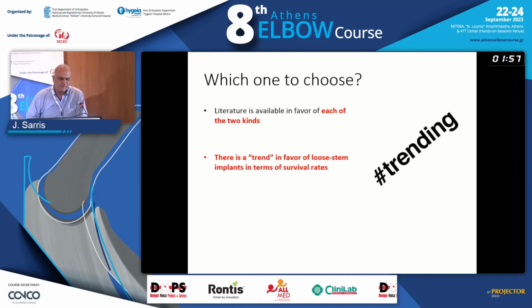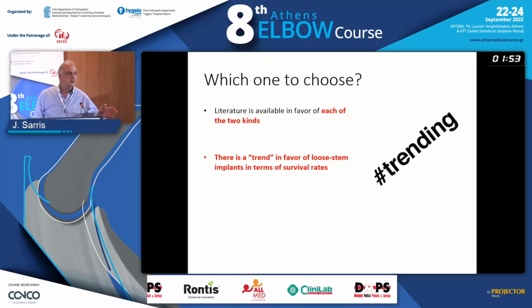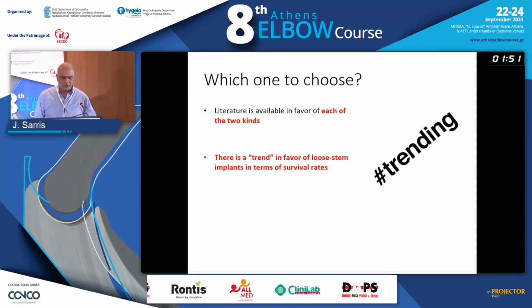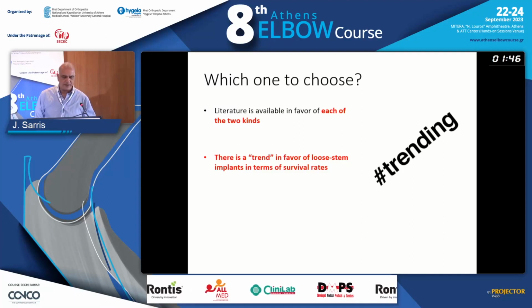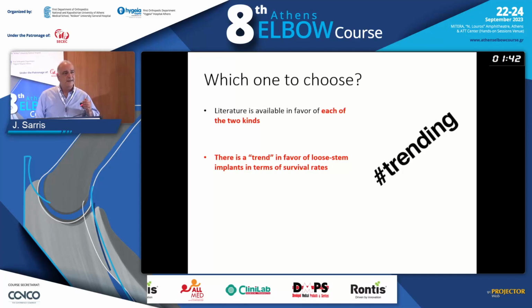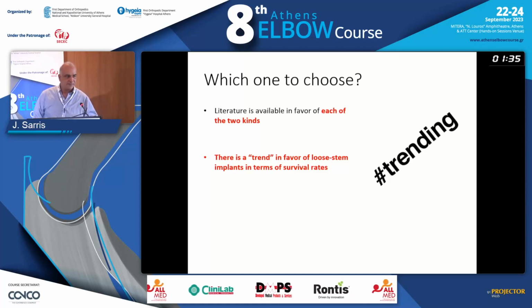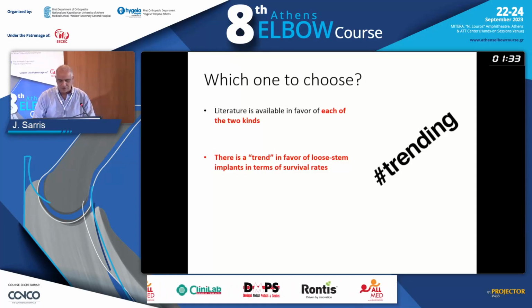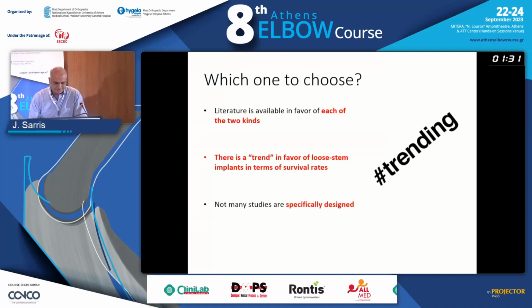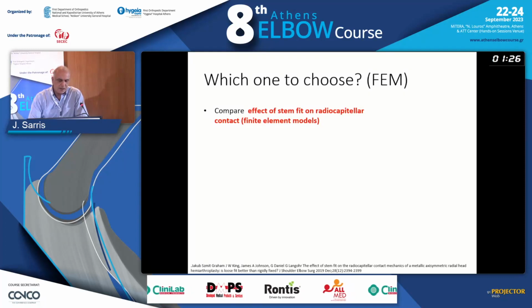So literature is available in favor of each of the two kinds. You can find literature supporting press fit or supporting the loose fit. There is a trend nowadays in favor of loose stem implants in terms of survival rate. I don't know if this is because we're going the right way, or because we don't have good fixation for the stems of the arthroplasty and of the spacer. We'll see that. Not many studies are specifically designed to compare the two.